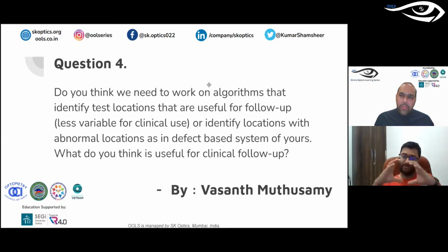If you ask me, we really want to place the locations at the edges of the scotoma. It is not just the depth, how the scotoma goes in depth; more than that, how the scotoma is growing in space is probably more important. So in that case, ARREST is probably a much better approach than defect-based sampling.